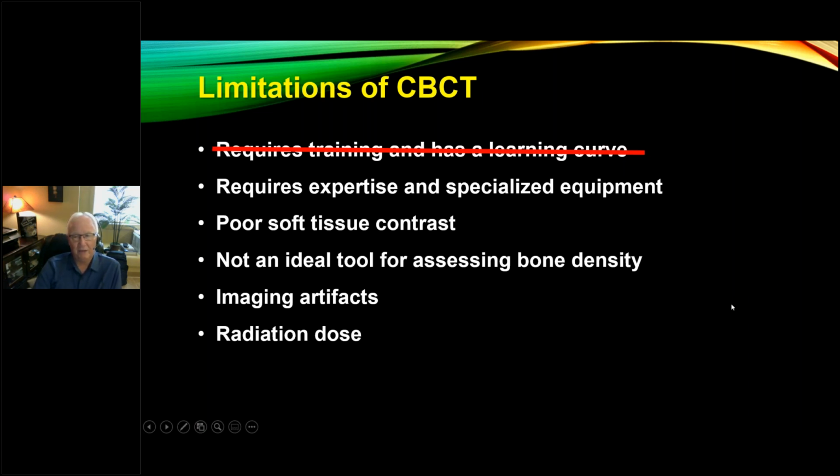There are imaging artifacts we can't get rid of. We can reduce them. You can do error correction sometimes in the programs. And the dose, this is coming from Europe. Europe and South Africa, they're kind of like sisters in this respect. They basically are all worried about microsieverts. And the dose is so low that I don't think it even should be a consideration.